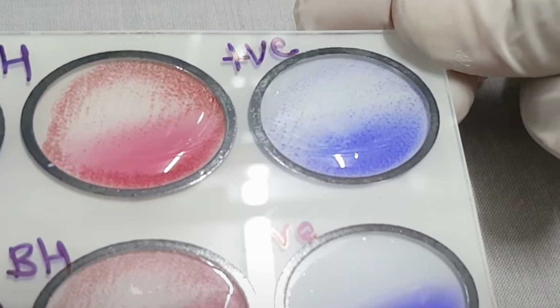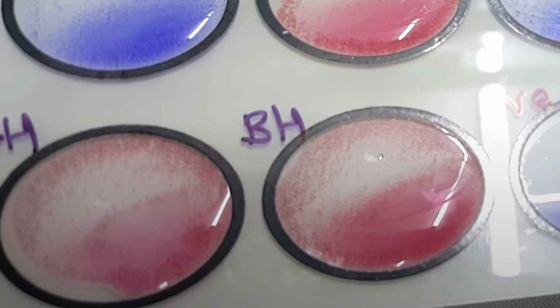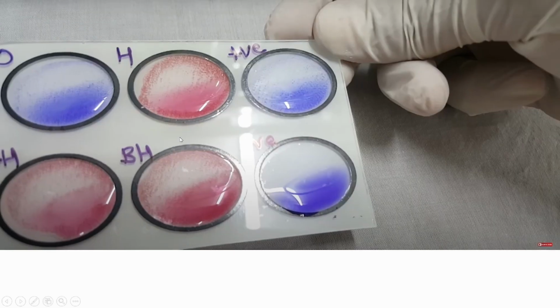Now this similar kind of thing you can see here also, here also, here also. So that means the patient is positive for O antigen, positive for H antigen, positive for AH antigen, positive for BH antigen. So this was the control, and you got the agglutination, the clumping of the antigen and antibody, they both reacted, and you found that the patient is positive for Salmonella typhi.